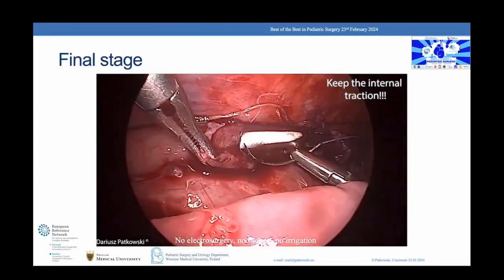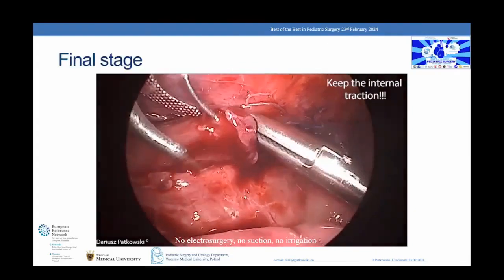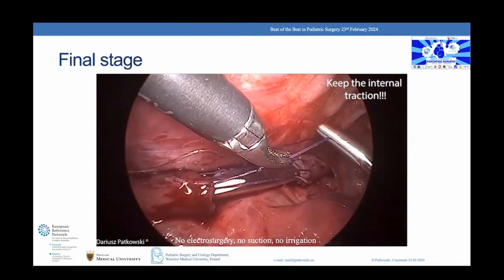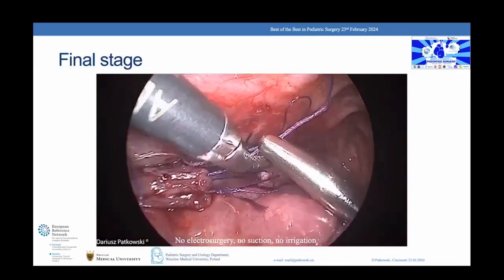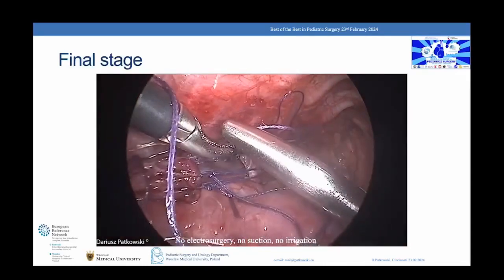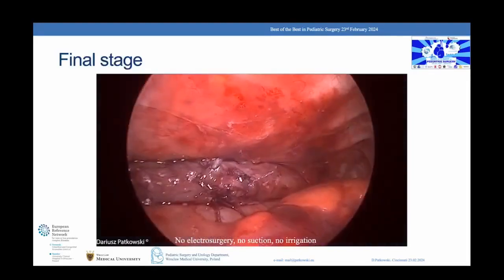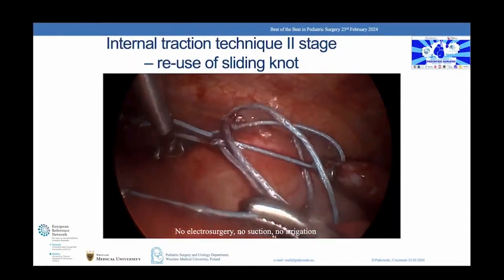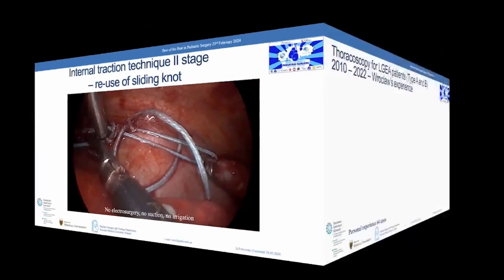The basis of the perfect anastomosis is a sliding knot. Typically, you need to place two or more sliding knots and then gradually close them. It doesn't matter whether the anastomosis begins from the anterior or posterior wall, as the anastomosis can be rotated freely around. If anastomosis is not possible, the sliding knots can be reopened and used again to bring the pouches closer together.